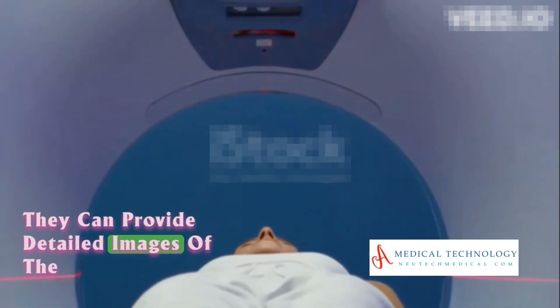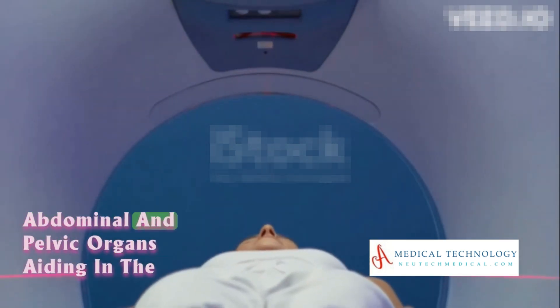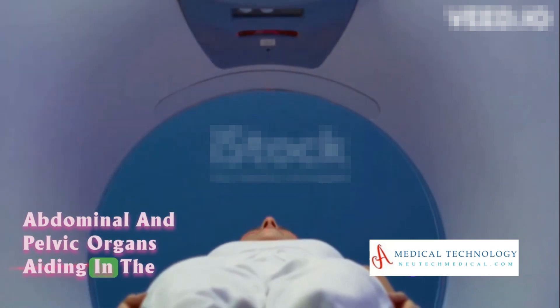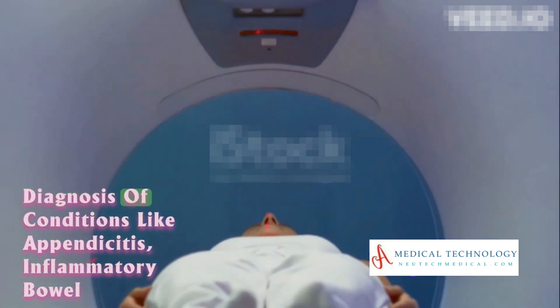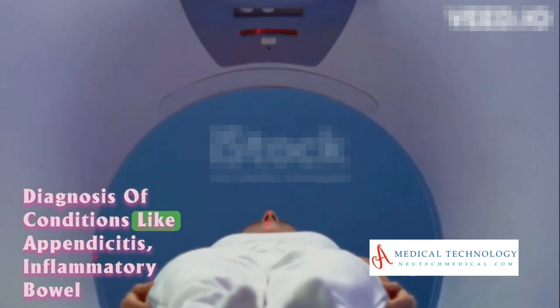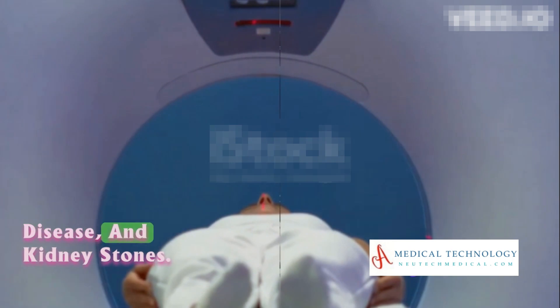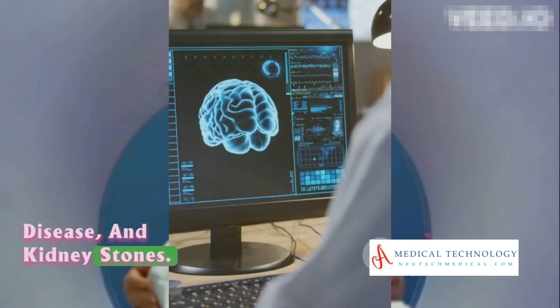CT scans can provide detailed images of the abdominal and pelvic organs, aiding in the diagnosis of conditions like appendicitis, inflammatory bowel disease, and kidney stones.